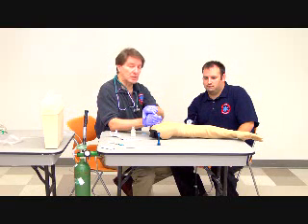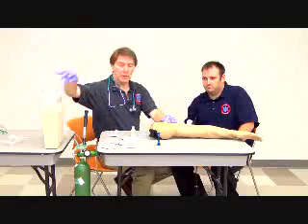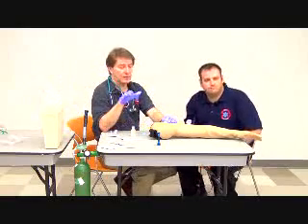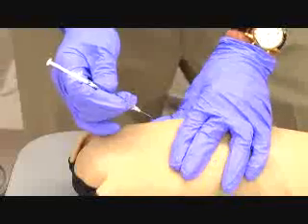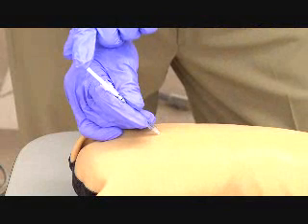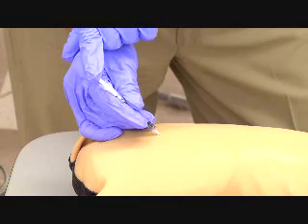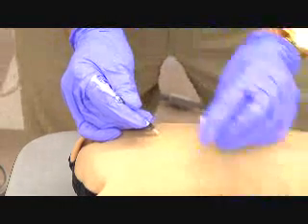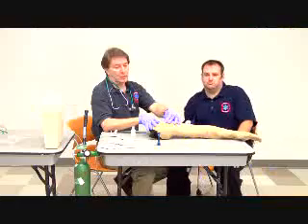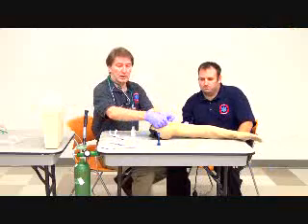Not super fast, but not super slow either. Roughly this rate is fine. I'm going to take my alcohol prep, cover the site, withdraw, and immediately place the used syringe in the sharps container. Never try to recap. I'm going to gently massage the site, and then I'm finally going to cover the site with a Band-Aid.